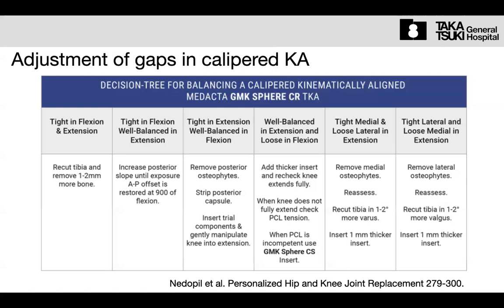But once we insert the femur trial, the posterior condyle of the femur component can push the posterior capsule posteriorly. Once we cut the posterior capsule vertically, we can get a big window for the femur component to be inserted in this hole.